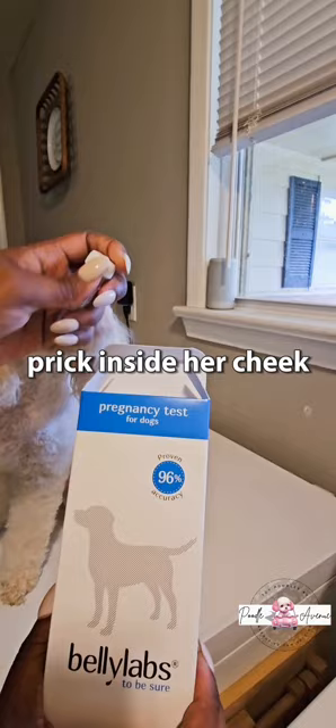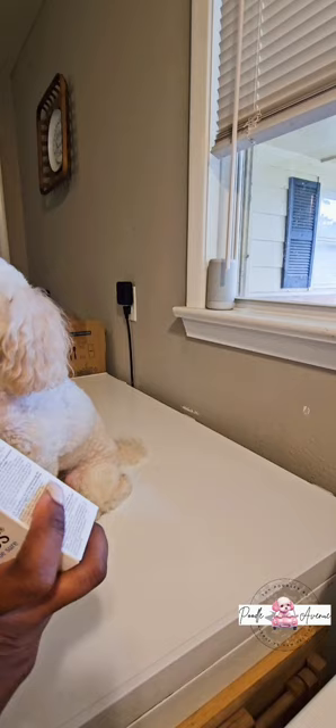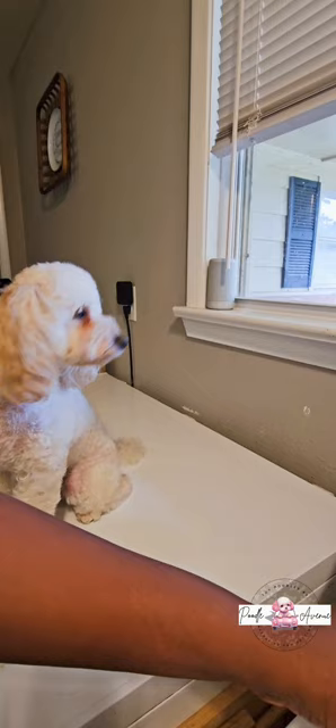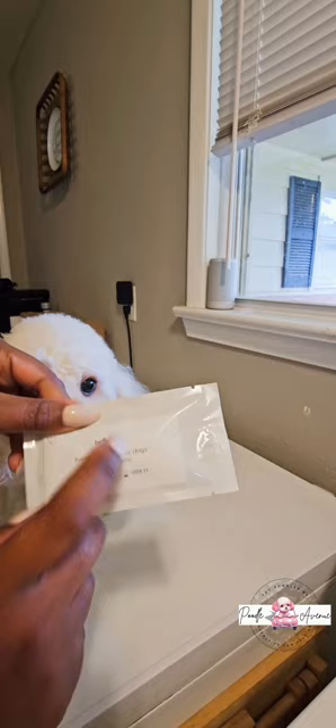Okay so this is the test and it's simple. You just prick inside her gum, use the cotton swab. This is the solution — you put your cotton swab in — and this is your pricker. It's only one test per box and each test runs around about, I say with taxes and everything, about 80 bucks.